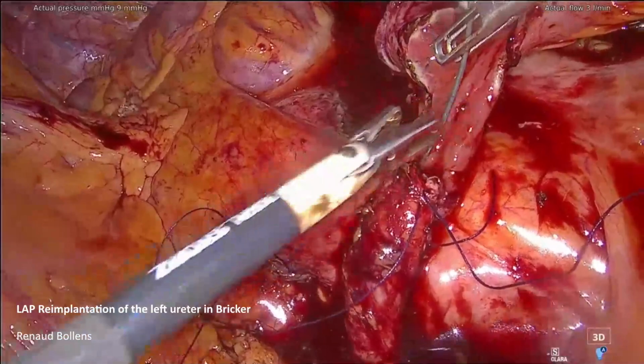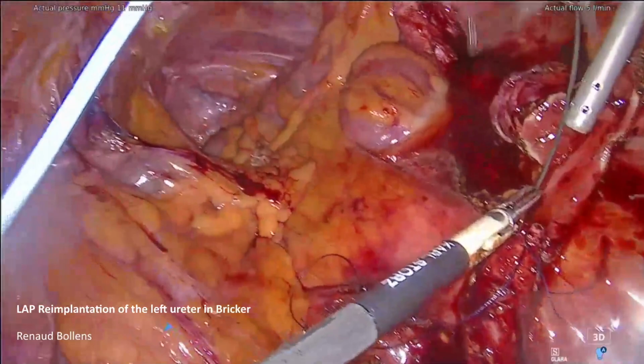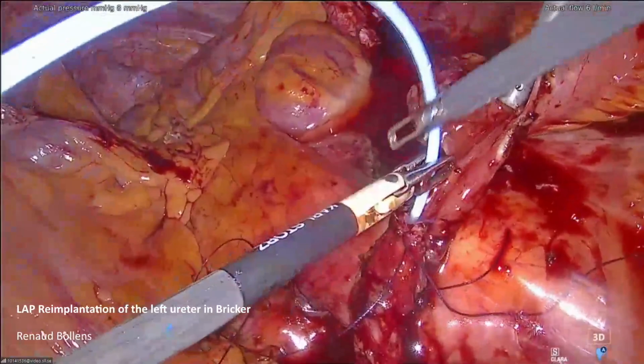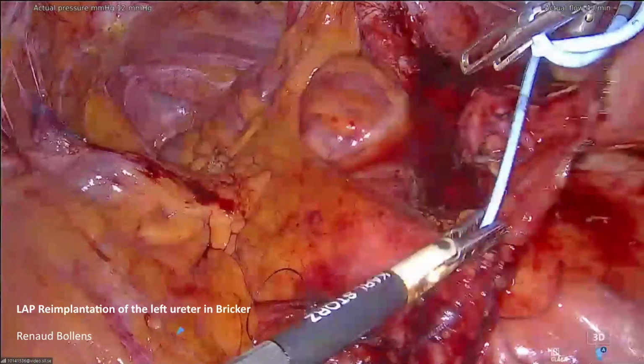Okay, push. Yeah. Push in, push in. Yes, more, more. Yeah, it's arriving. Well, it will be too long, yeah. Oops. Sorry. Show me back. Two. Three. Okay, look at me. The bladder should be there normally. Okay, you can remove the guide wire. Yes. It should be long enough. It should be in the kidney. Good. You remove it completely. It should be in the kidney because the bladder is normally at that level.